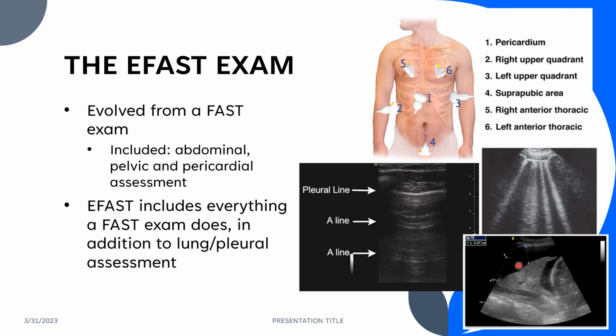If it's an older bleed, it tends to begin to organize, and it will start to present much low-level echoes, and then as it gets more and more mature, it becomes more echogenic or bright. So if you see something like this, it could be serous fluid, or it could be blood.